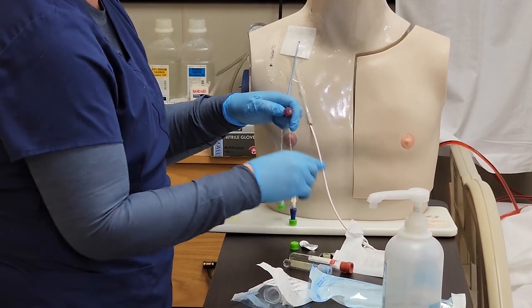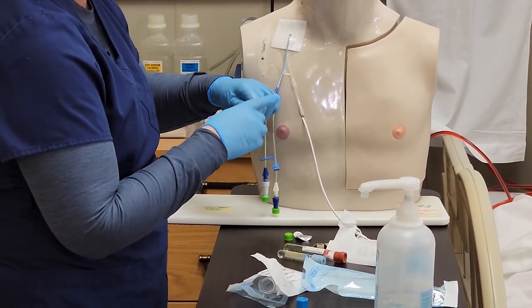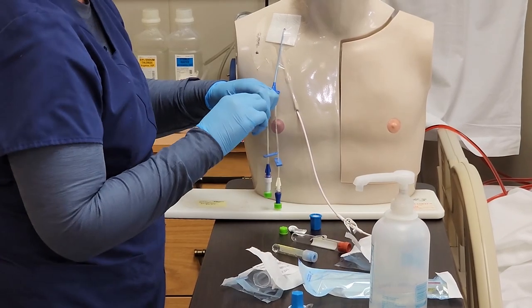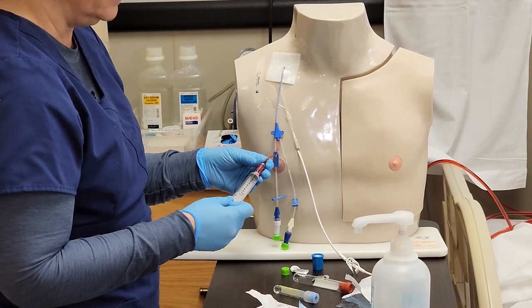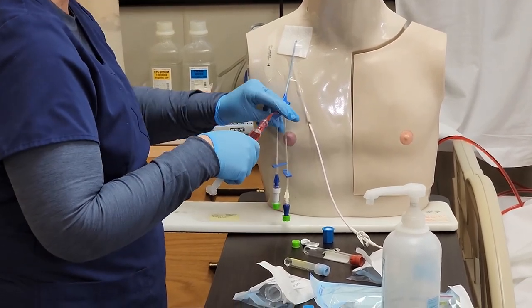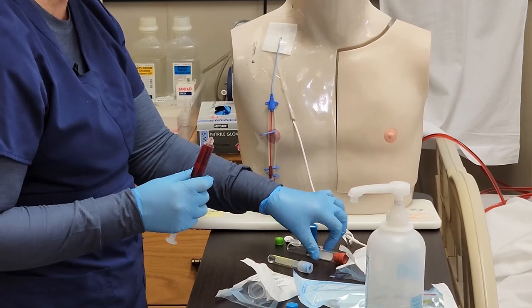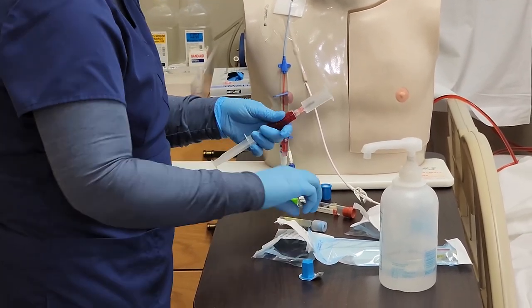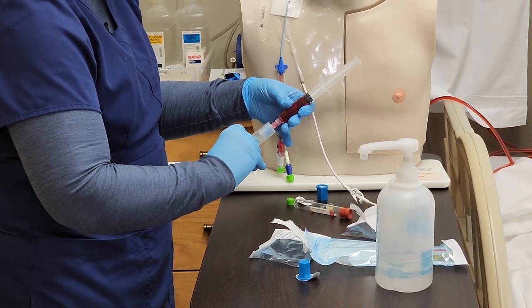The lumen is clamped and now I'm going to disinfect for at least five seconds. Now I'm ready to withdraw the blood sample. I take a sterile 10 cc syringe, attach it using non-touch technique, unclamp, and withdraw the amount of blood I need for my sample. When I have obtained the blood I need, I clamp again and transfer the blood into my blood collection tubes as soon as possible.